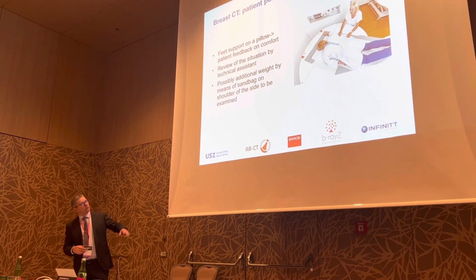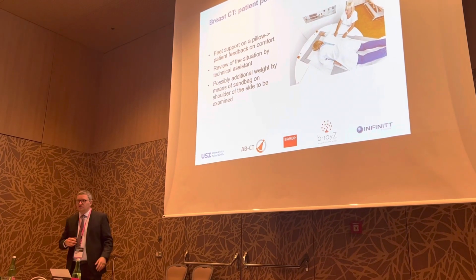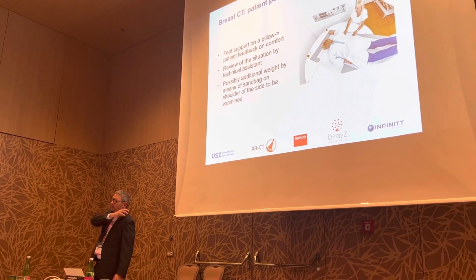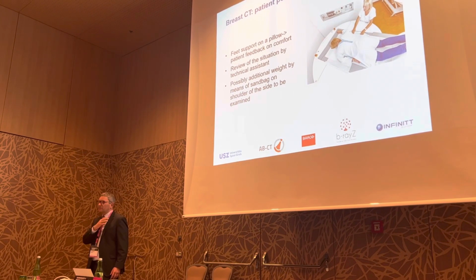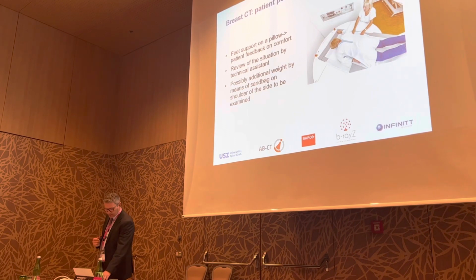Yeah, to make it more comfortable, you can make a little cushion below the feet, and also to keep it stable, so that there is no patient movement, you can put a little sandbag on the shoulder of the examined breast, and thereby the images will get a little bit better.